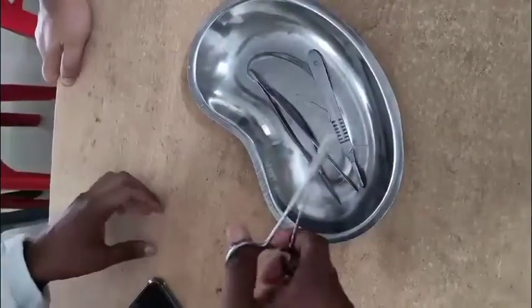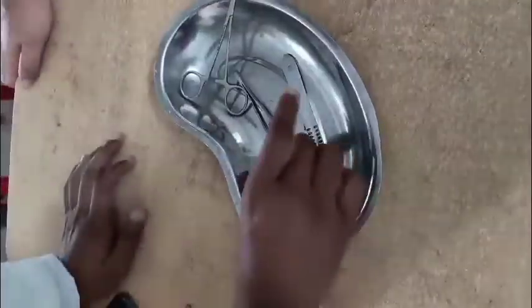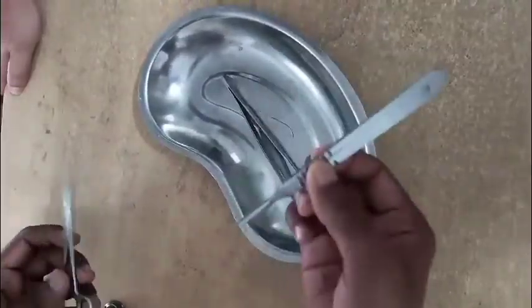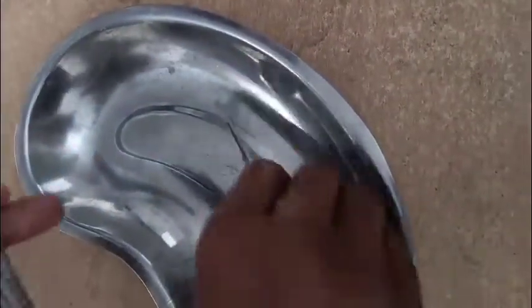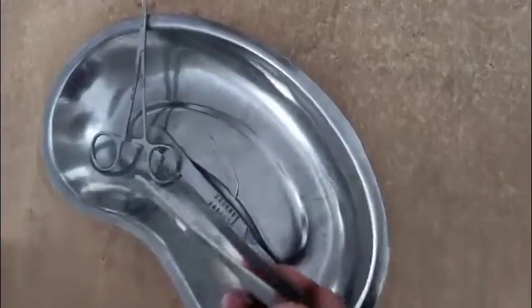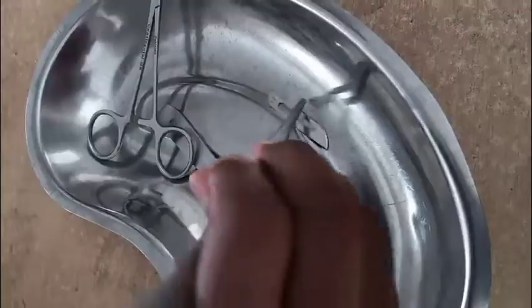This is a procedure where we have to set the BP blade to the BP handle. Here are some instruments: this is the mosquito artery forcep, this is the BP handle, this is a plane forcep, and this is the BP blade. First, we have to grab the plane forcep and by the plane forcep we have to grab our BP blade.